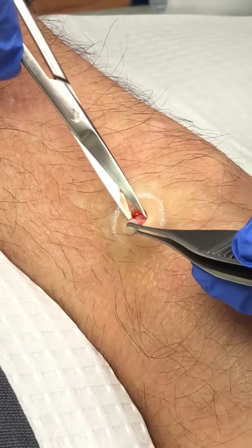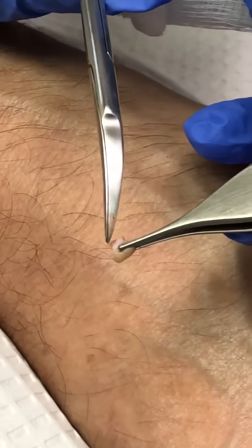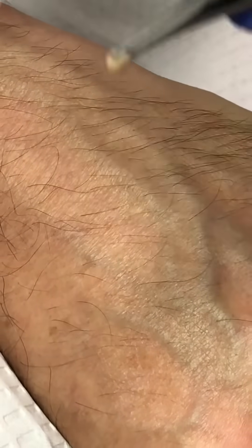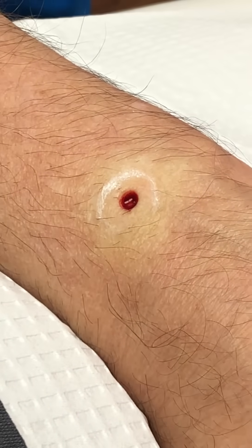If we look at the specimen, I see a little neoplasm right within the biopsy. It could be a neoplasm of nerve tissue because it's so clear. So that would be my thought — maybe it's some type of a neuroma. And we'll send that off to the pathology lab.